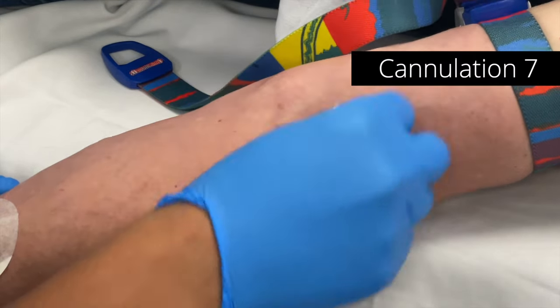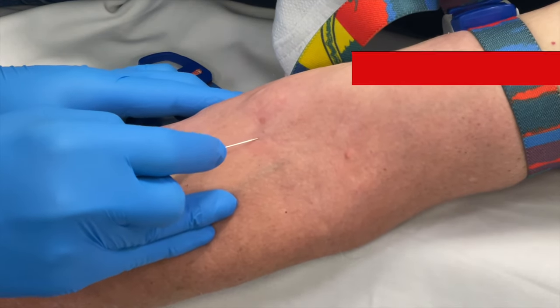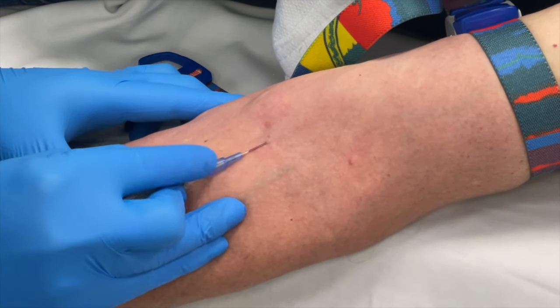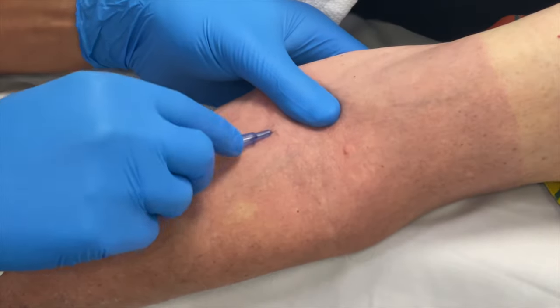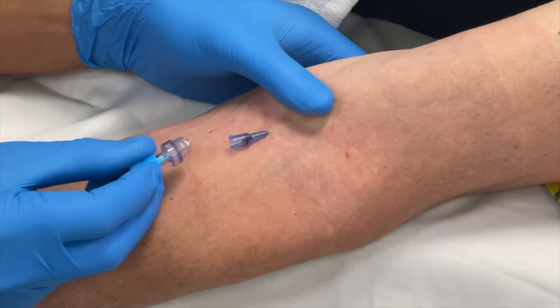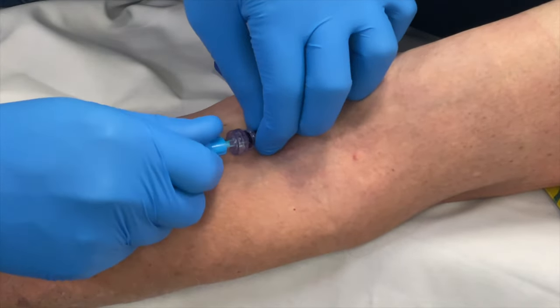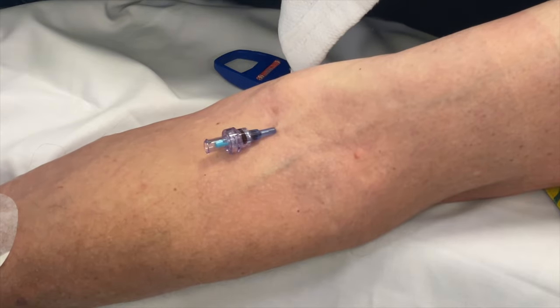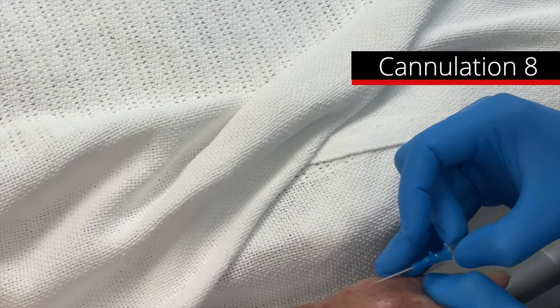For this cannula I'm sterilizing the area with a Clohex alcohol swab, making sure the patient has no allergies, and going for a palpable but not visible vein. That region has lots of structures. This particular cannula is not my favorite — it doesn't have a bung, and it also doesn't have a safety needle and it twists around a lot when you thread it through. I just demonstrated taking pressure off the thumb to see if I have backflow — that's one of the techniques I use to confirm I'm in the vein. Lack of backflow doesn't necessarily mean you're not in the vein, but the presence of backflow is really reassuring that you are inside the vein.